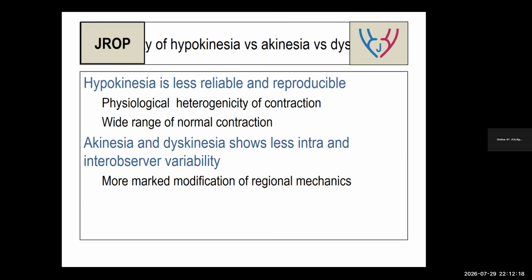Sometimes it's generalized hypokinesia, like you were saying, stress-induced, sepsis-induced, or severe anemia in post-op patients. How to differentiate? Don't confuse now. What we were talking of is an aneurysm, that is a bulge, an apical aneurysm, or reversal of segments. The apex remains contracting, the basal segments become akinetic.